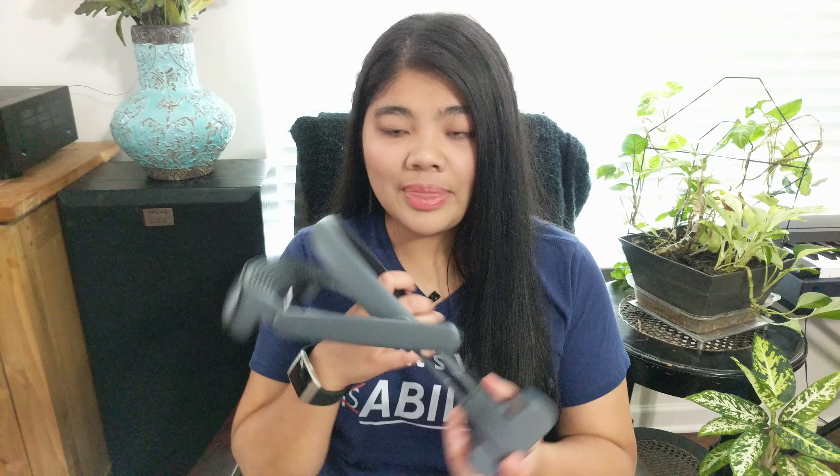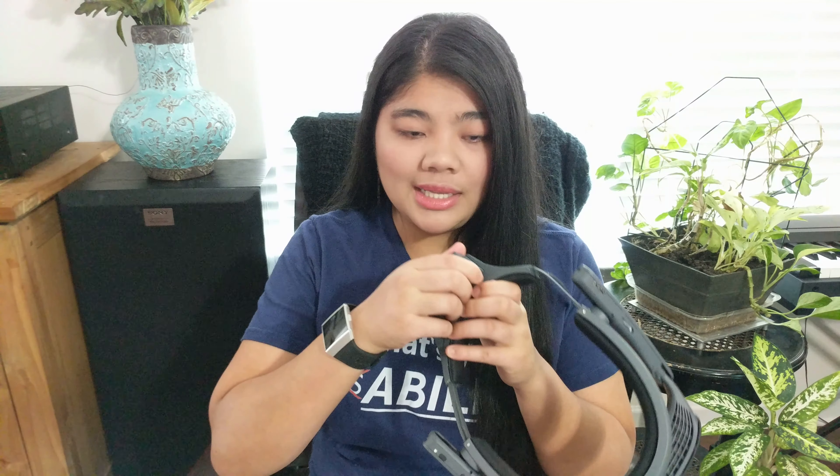Another difference is the battery. With the eSight 3, the battery is in the remote, and you can also get an external battery pack but you'd have to purchase that. Whereas with the eSight 4, the batteries attach directly to the device, it's reversible — you can put it in both ways — and if you shake the battery, it gives you a light indication of the battery level. It comes with two batteries and you can purchase more.